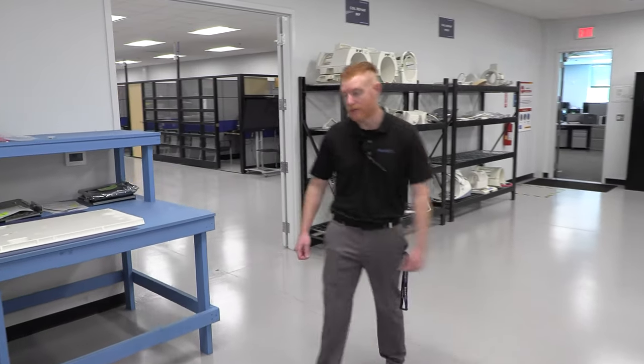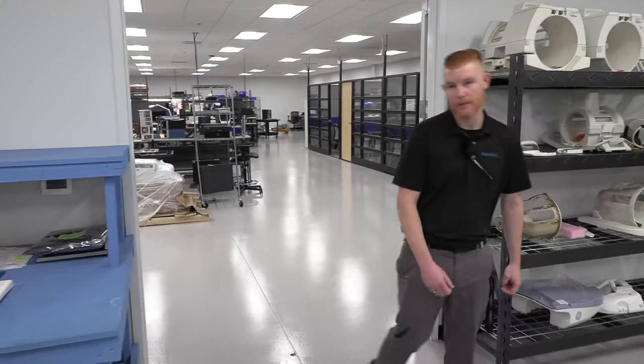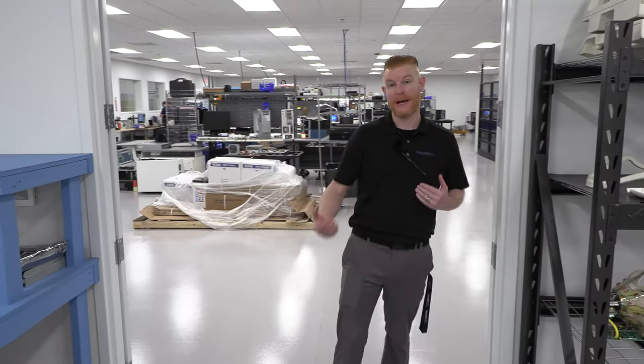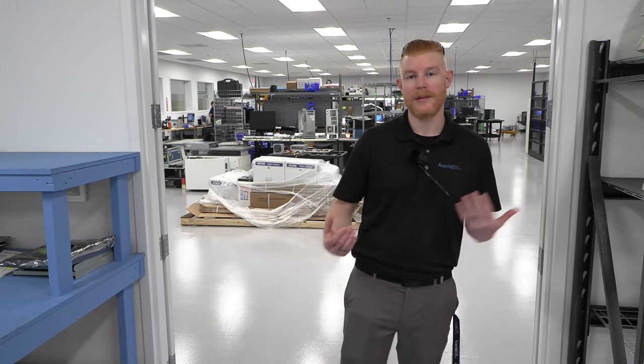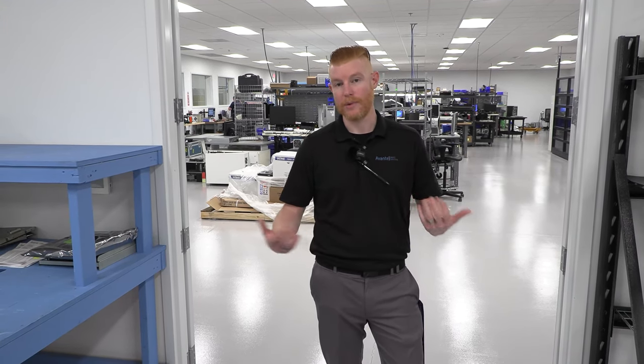So next door here is our advanced repair lab. We are set up here to, obviously, you mentioned not having schematics, right? So one of the challenges we face is trying to figure out how to get from point B back to point A when we're troubleshooting something. So the team next door is primarily set up to help us with that. We could take a part and break it down, go backwards with it, and figure out how it fails, the trends, things like that, and then create a repair process around it.